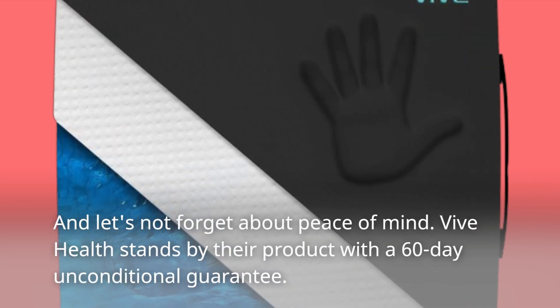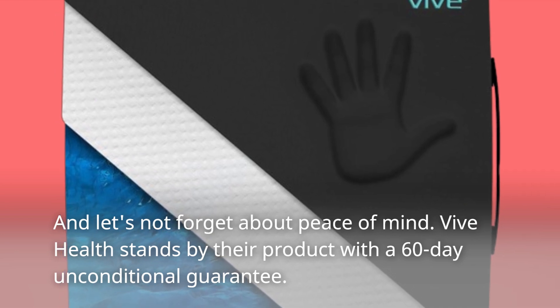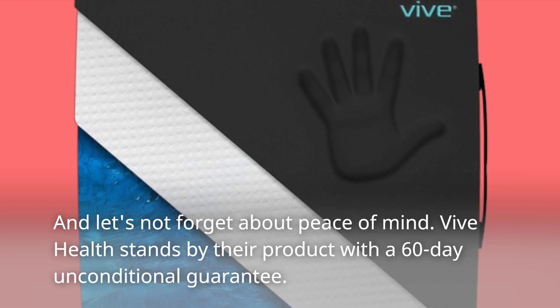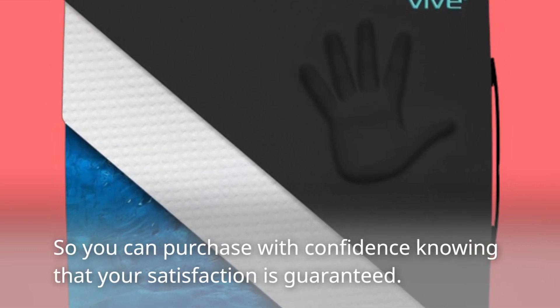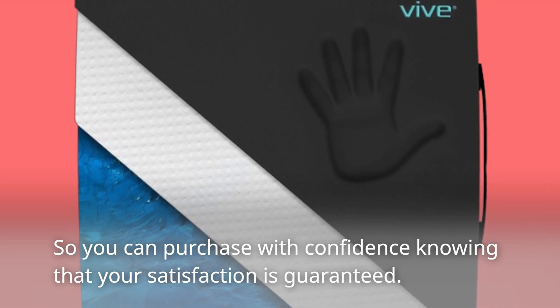And let's not forget about peace of mind. Vive Health stands by their product with a 60-day unconditional guarantee, so you can purchase with confidence knowing that your satisfaction is guaranteed.